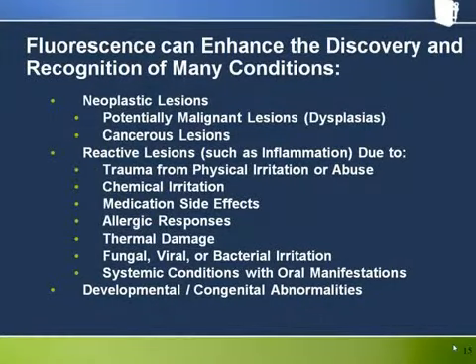We've focused on the reasons why we expect to see a loss of fluorescence from dysplasia and cancer. However, it is important to understand that fluorescence pattern changes are associated with many different types of lesions. Moreover, this is a benefit rather than a limitation of fluorescence visualization. To be sure, neoplastic lesions are arguably the most serious and life-threatening in the spectrum of diseases that affect the oral cavity. However, the many other types of conditions are definitely worthy of the clinician's attention and can have a significant effect on the quality of life of the patient.